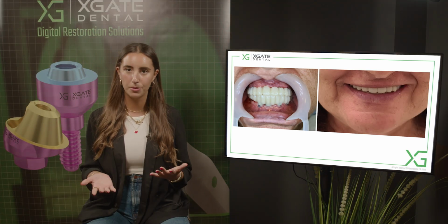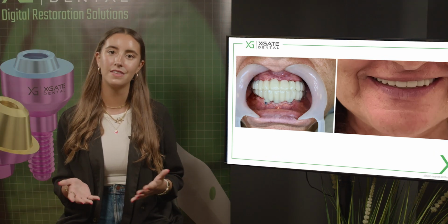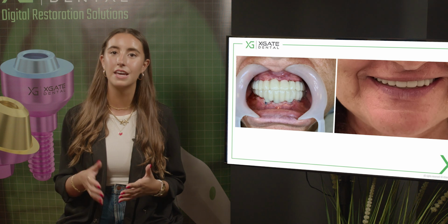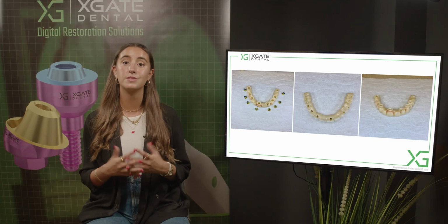And you need to compensate for all the things that you had before. And the same thing for the implants on the lower jaw. So we took those bridges, and in the end, she was satisfied with the smile, the lip line, and the aesthetical central line, everything was fine. And now we want those bridges to be made from zirconia.